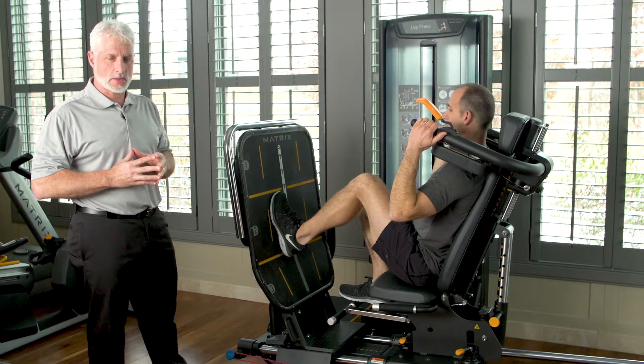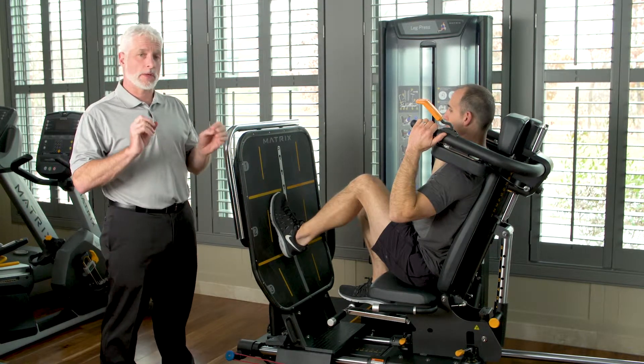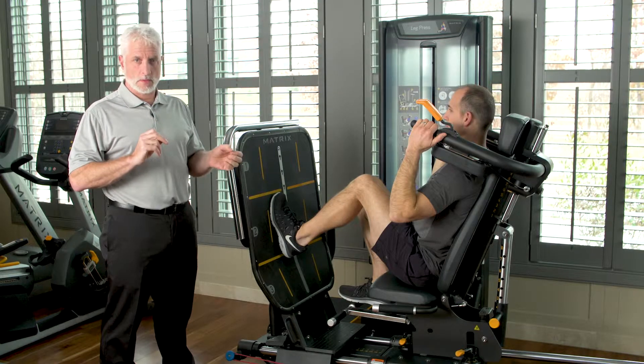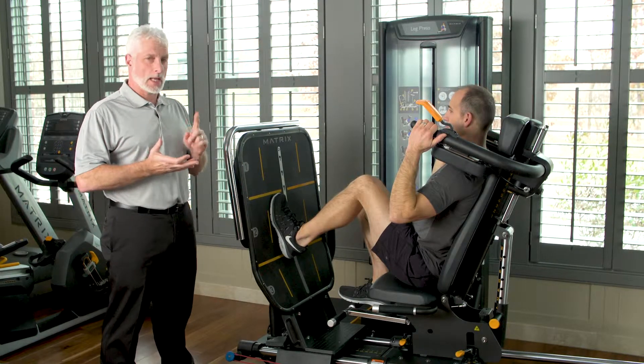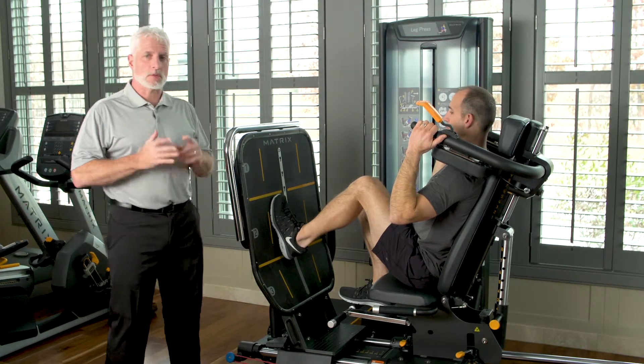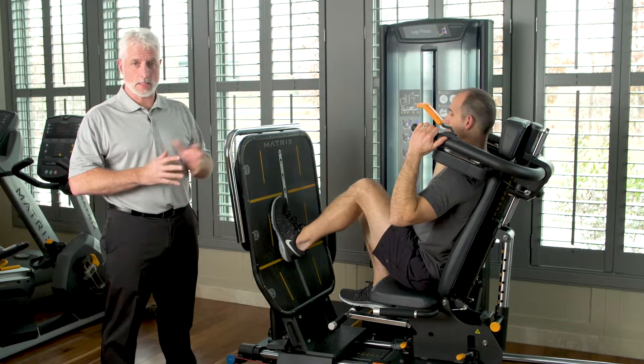Next we're going to talk about ACL reconstructions with this leg press. This leg press is unique because you can isolate small range of motions and not create any issues with the ligament reconstruction — whether they use an allograft, a hamstring, or a patellar tendon, it doesn't really matter. As therapists, you know you have to gradiate how much range and how much weight you use while performing a leg press with an ACL.